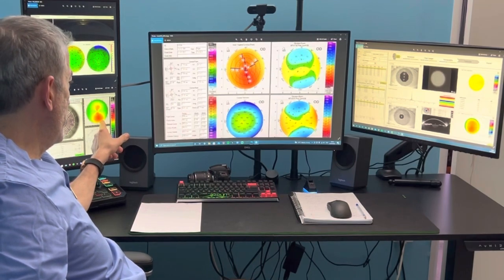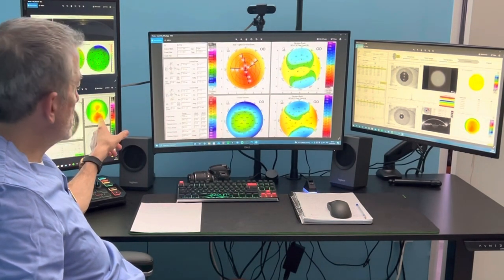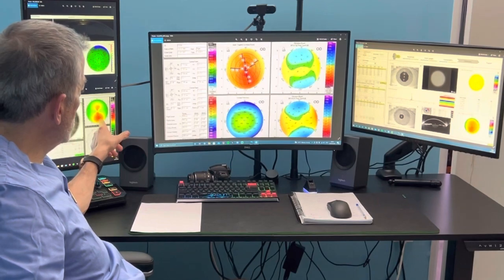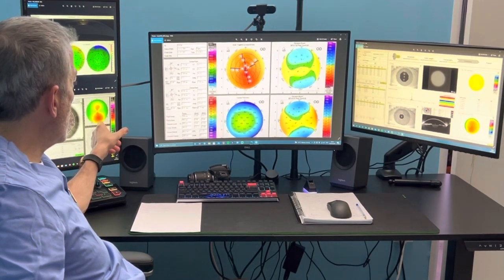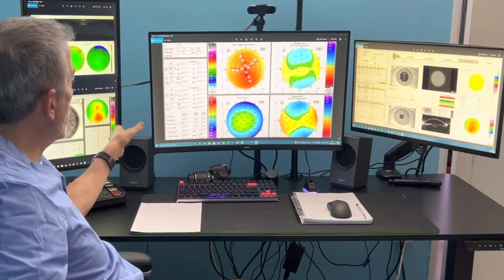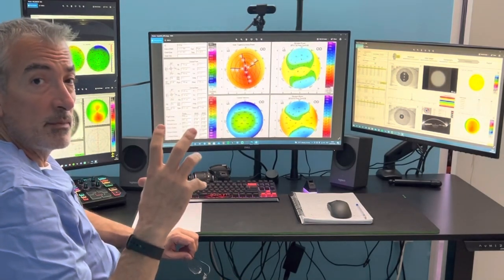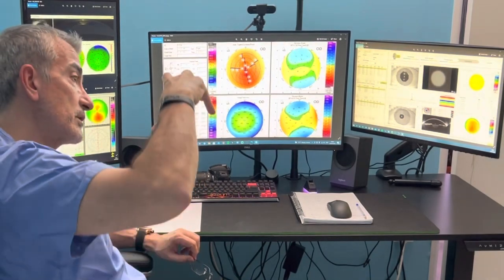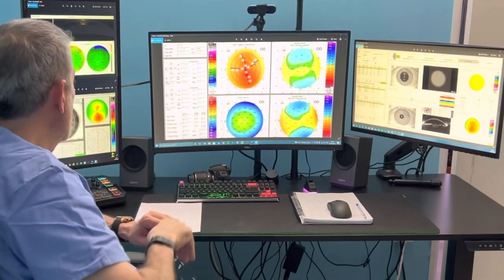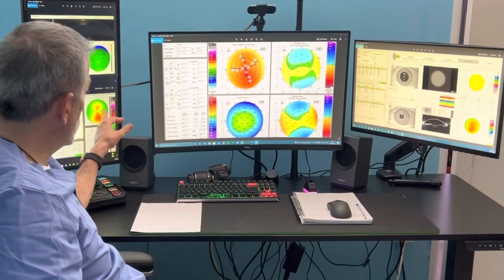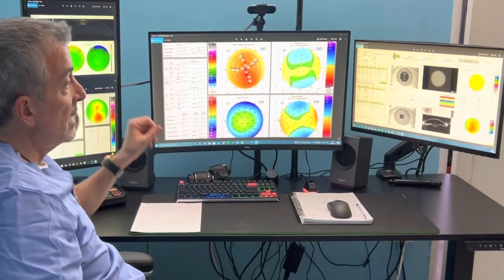The fact that we have inferior steepening — remember, this could just mean significant angle kappa on the Y-axis, meaning the imaging device is looking at the cornea downwards — and this could cause fake inferior steepening.